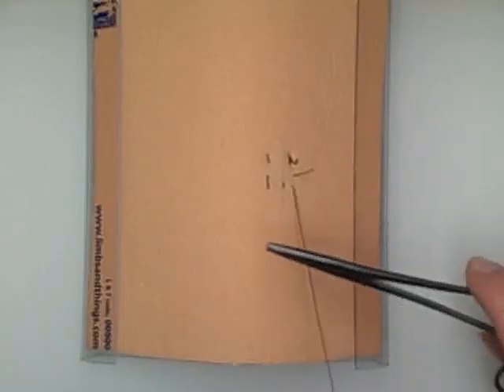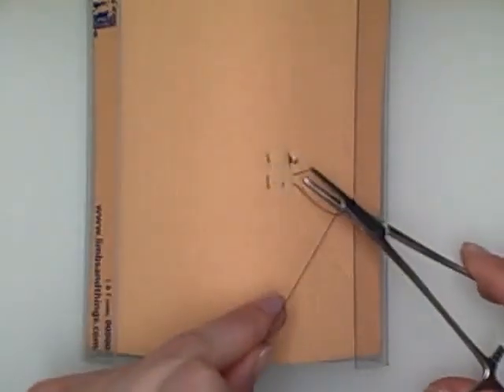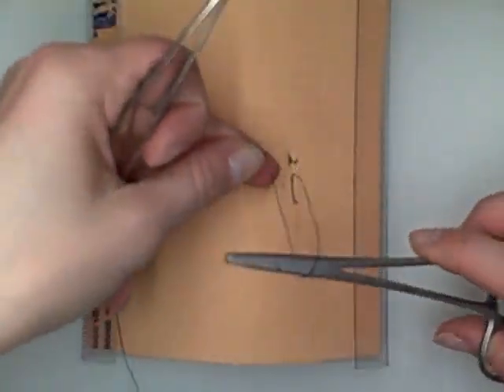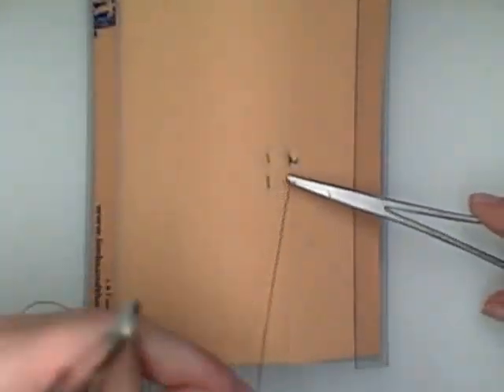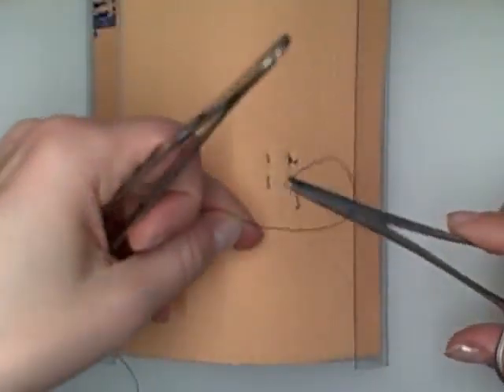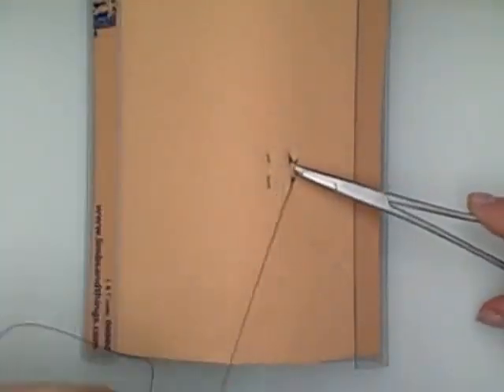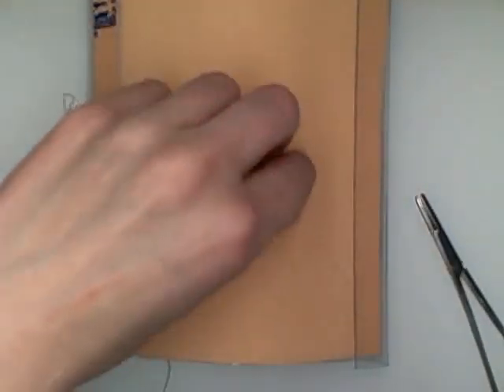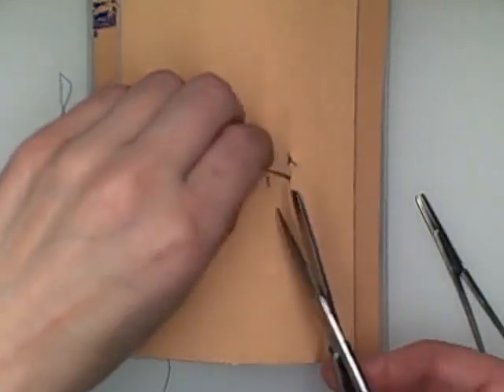Okay, now we're ready for our instrument tie. Got a very short tail here. I'm going to leave a little bit of a tail on this when I cut it. Just like that.